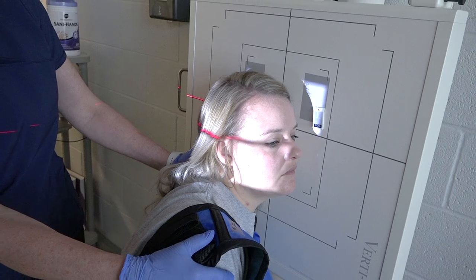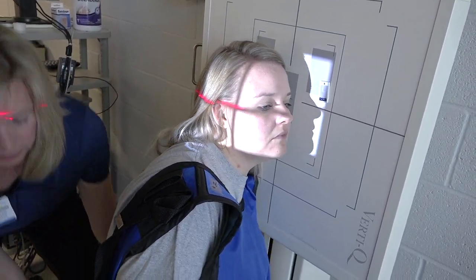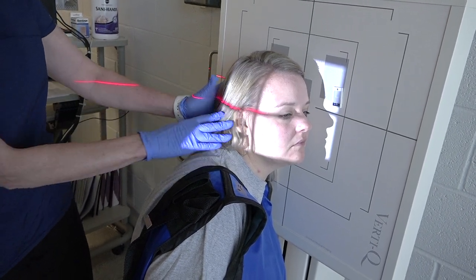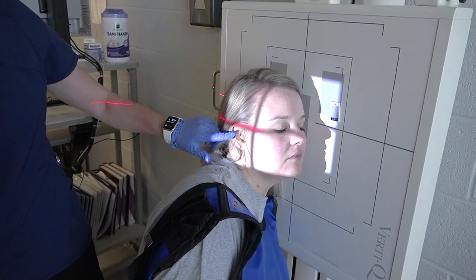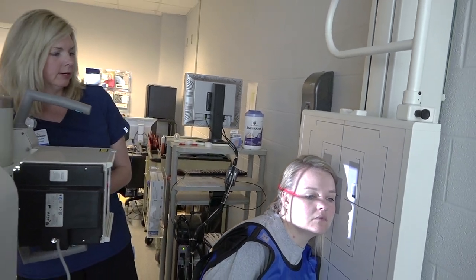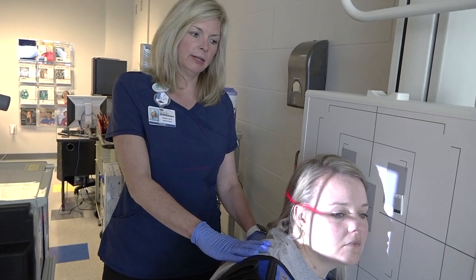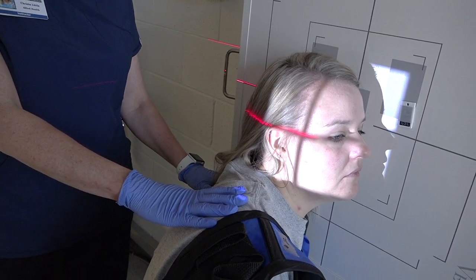I'm going to move you back just a little bit. Our centering is in between the outer canthus and the EAM. We're just looking at the sinuses here. With the lateral, all 4 sinus groups are demonstrated: the frontal, the ethmoid, the sphenoid, and the maxillary.